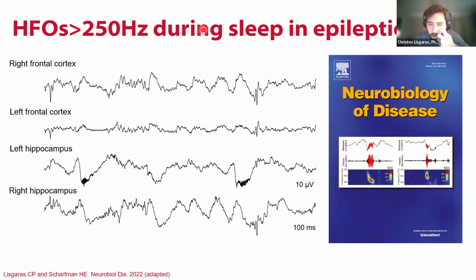But for closed loop optogenetics, you also need to consider that a fiber is going to be implanted, so I bundled the fiber with the electrode. But I'm happy to talk offline about what type of electrodes we use and what works for us, depending on what you would like to use.